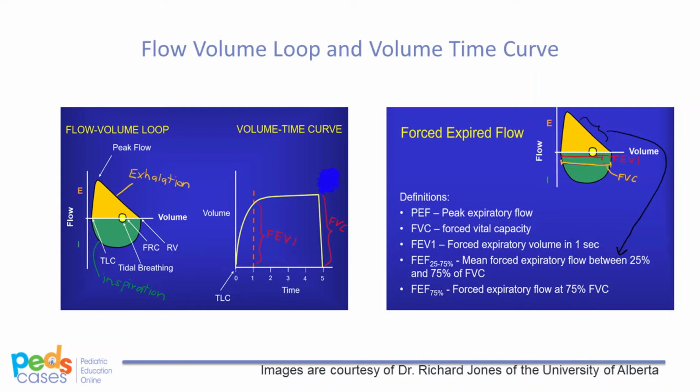Generally, children younger than 6 years of age will not be able to do spirometry reliably. There are also specific technical criteria which define what is considered an interpretable test. To interpret the flow volume loop, there are a few important parameters to know about. You can follow along on Figure 3.